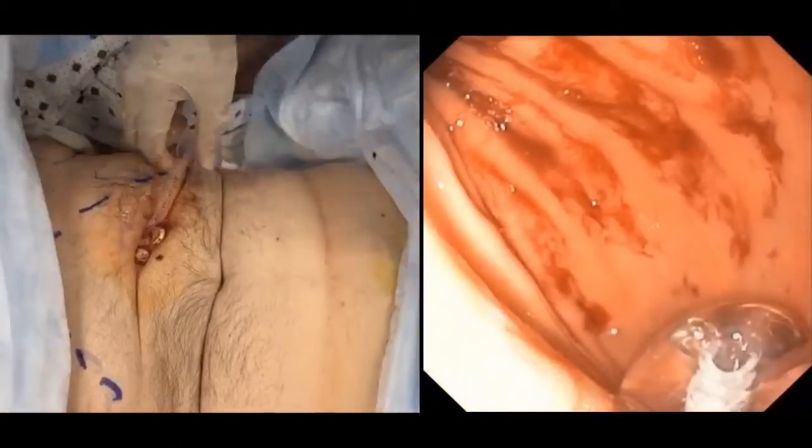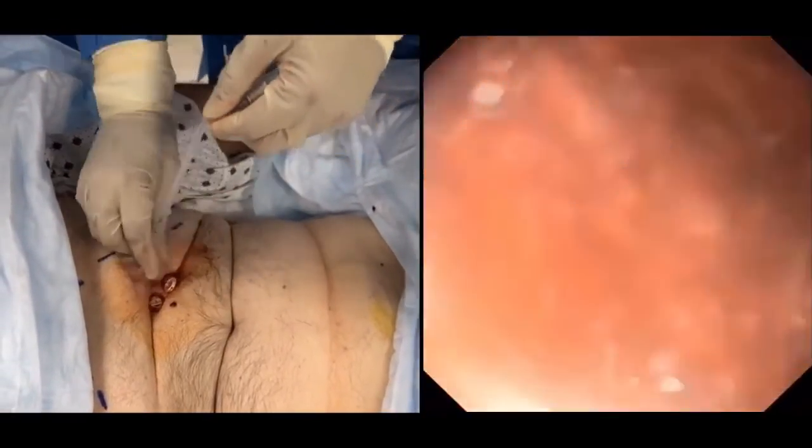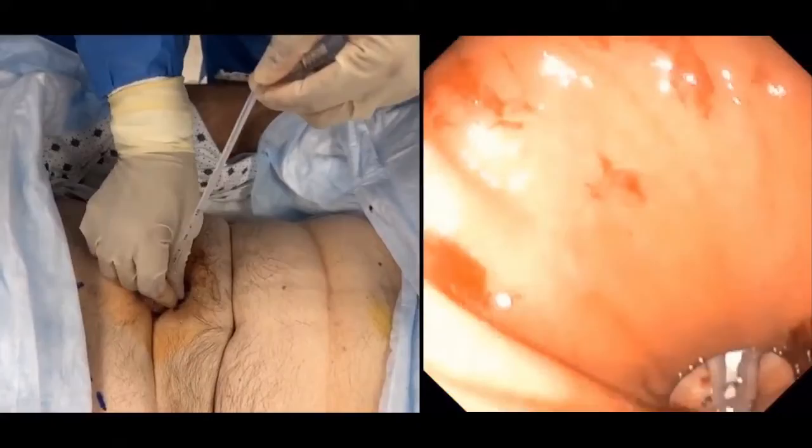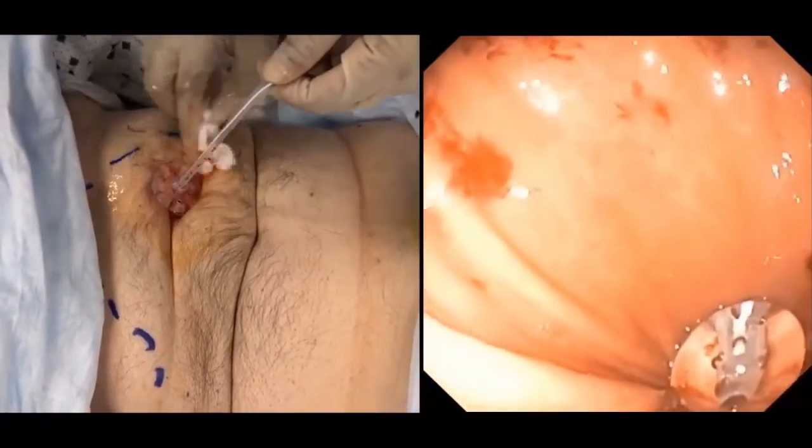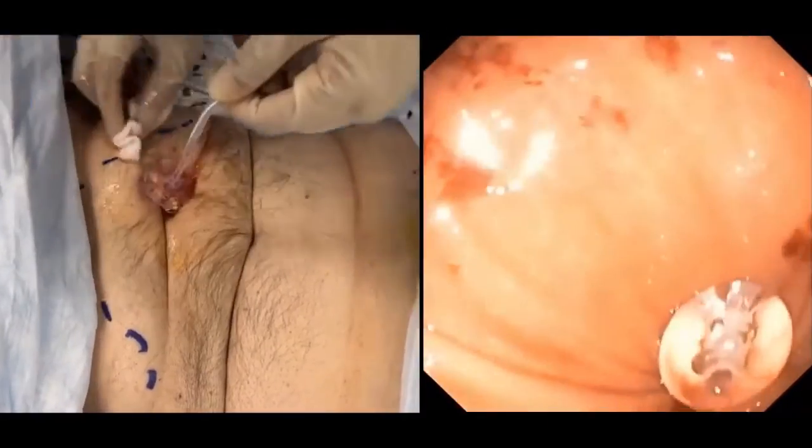Now we can see the inflated balloon inside the stomach. We then clean the area and approximate the external retention ring to the skin. The T-fasteners are absorbable and will fall off on their own if left in place.